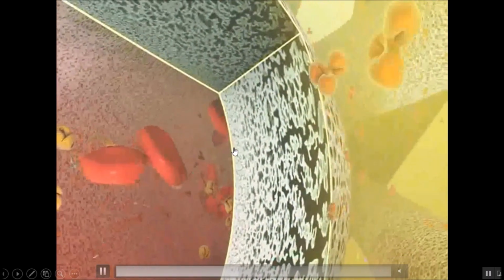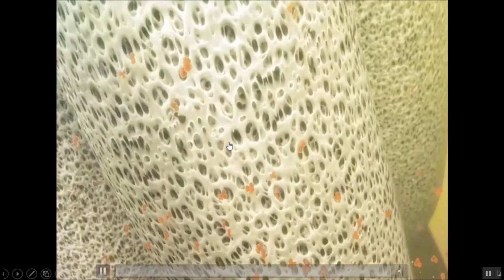Most hemodialysis membranes now are called asymmetrical membranes, with synthetic membranes having the internal porosity smaller than the outer porosity. Contacting the blood with the inner surface of the membrane can induce severe reactions, can induce thrombogenicity, can induce immune reactions, and this could be transmitted to the patient's blood.